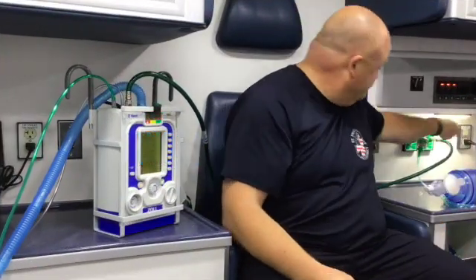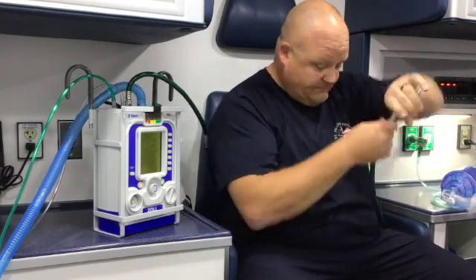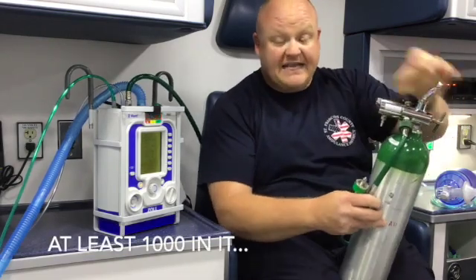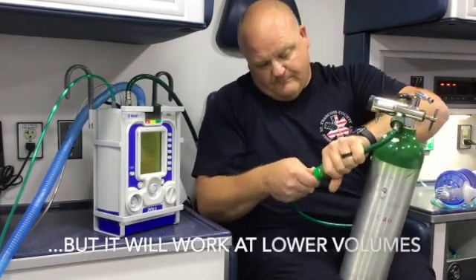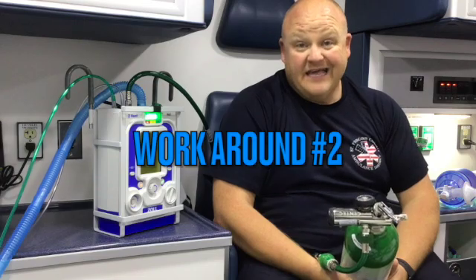The first thing you can do — quick and easy — disconnect from the wall immediately, get your small tank, make sure your small tank is on and there's air in it, connect it, and your alarm will go off by itself.